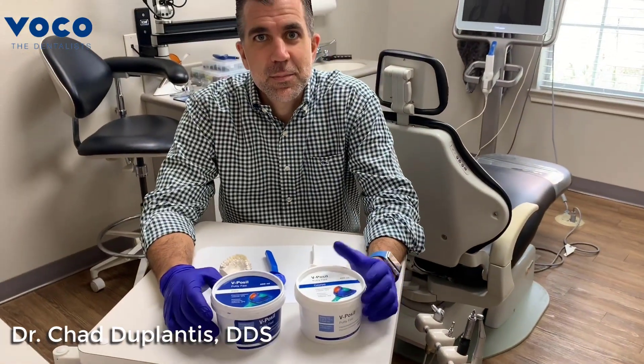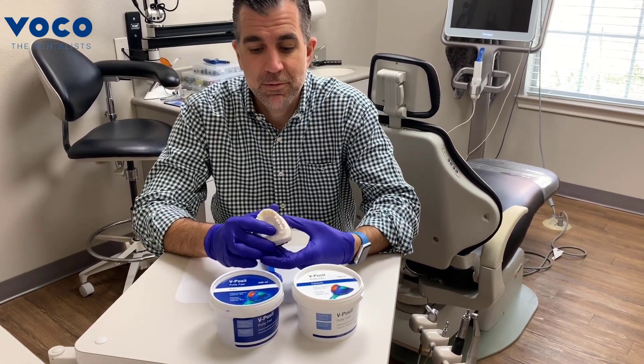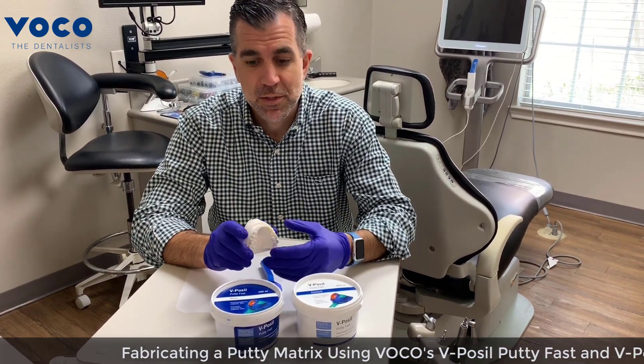Hi, I'm Dr. Chad Duplantis, a practicing clinician in Fort Worth, Texas, and today we are going to fabricate a putty matrix on a wax-up that we received from the laboratory.